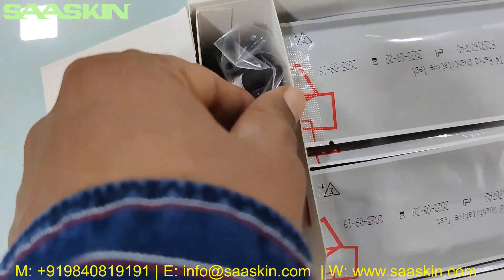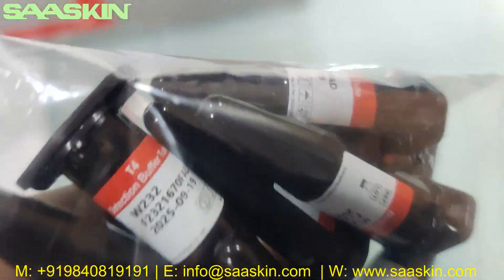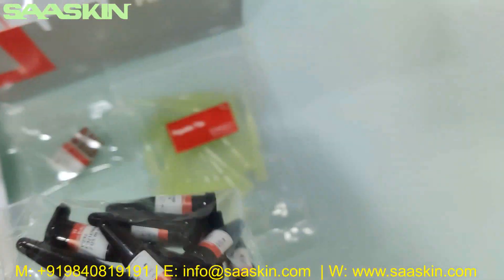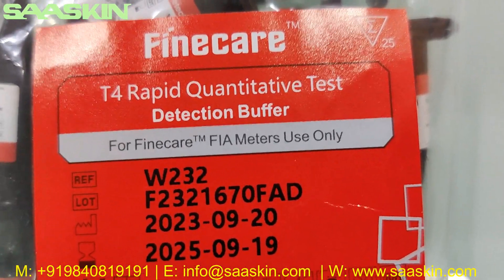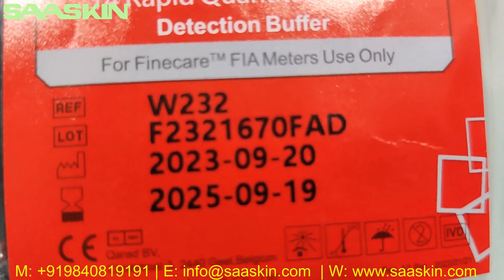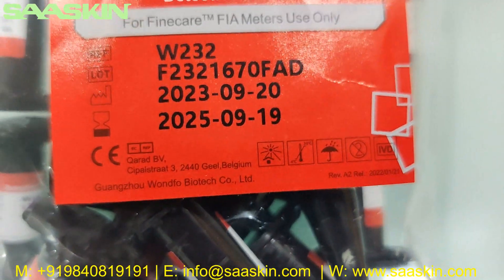Then you get 25 detection buffers — individually packed buffers with the same information on them. These are the T4 Rapid Quantitative Test detection buffers. You can see the reference part number, lot number, the manufacturing date, and the expiry date.